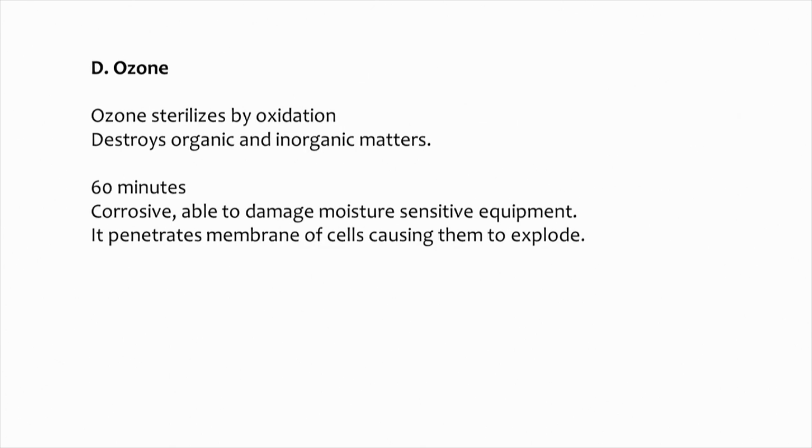Of course, ozone. Ozone, as you know, is a very good oxidant, so it can also sterilize. It destroys organic and inorganic matter. Generally 60 minutes. It is also very corrosive. It may damage moisture sensitive equipment. It penetrates membrane cells, causing them to explode.